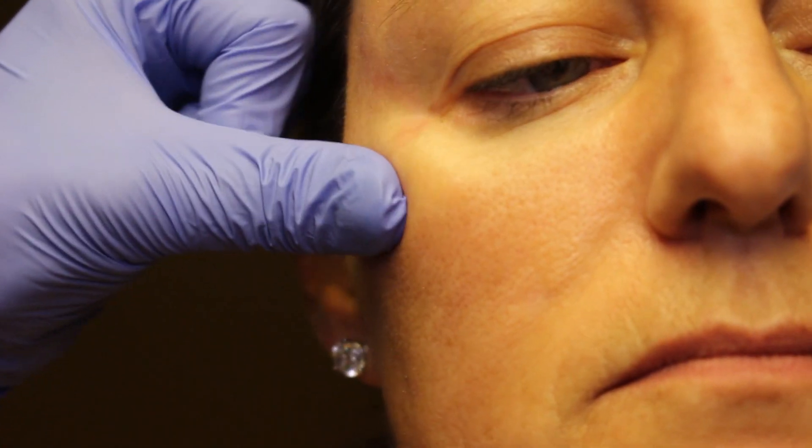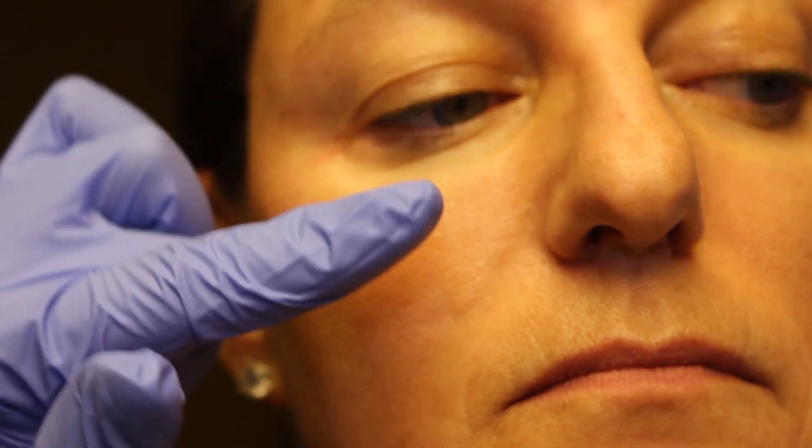I love volumizing — this is an important area of the face. It also keeps this geometry, and it pulls here, so you don't need as much filler here when you're augmenting the cheek. It's just going to rejuvenate that cheek. So really fairly painless — would you agree? And then we're heading this way, going around things, not going through. You can see there's the tip of the cannula, so just slowly, slowly augmenting the cheek.